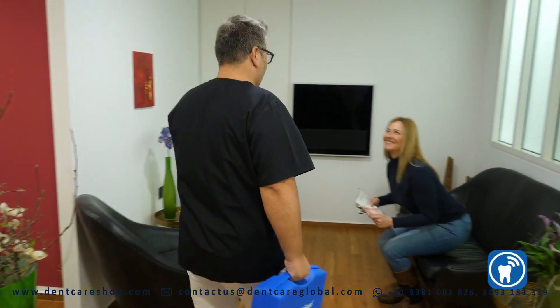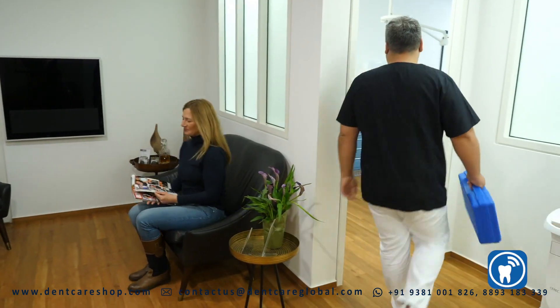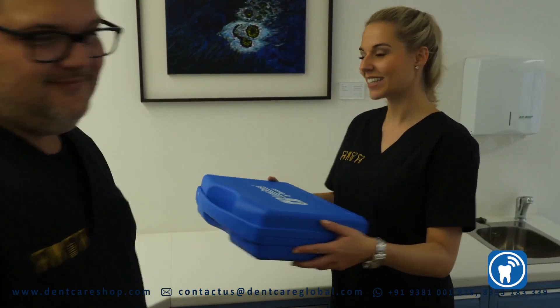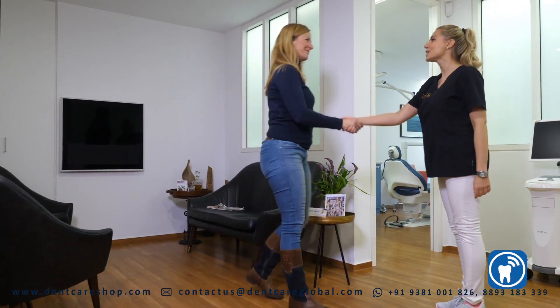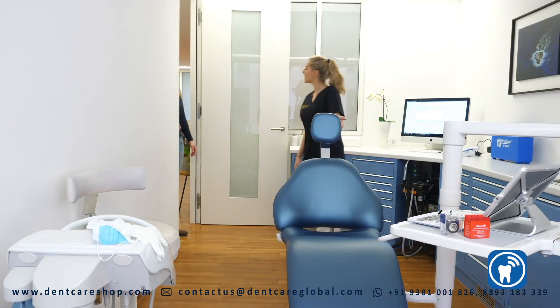Occlusense by Bausch. The new Occlusense system developed by Bausch combines the traditional and digital registration of the pressure distribution of the occlusal surfaces. The Occlusense device is being used in combination with a 60 micron thin single-use pressure sensor coated with red color.